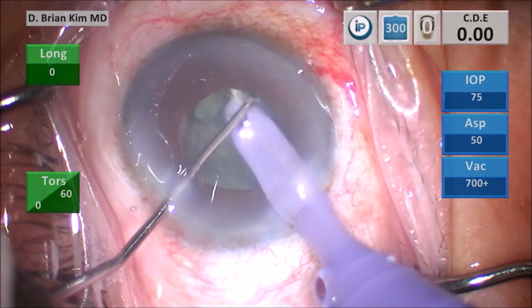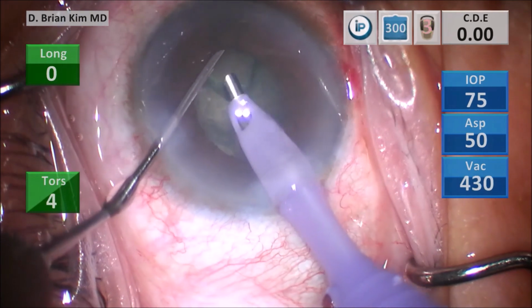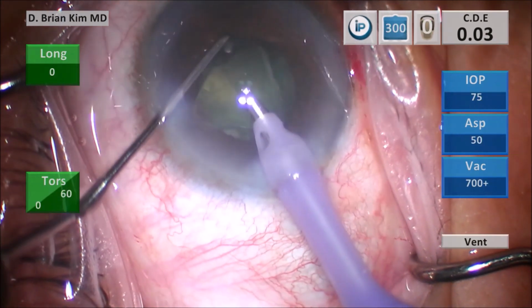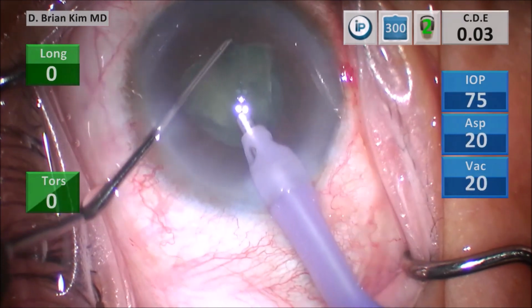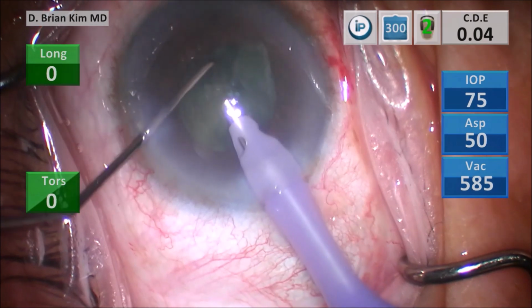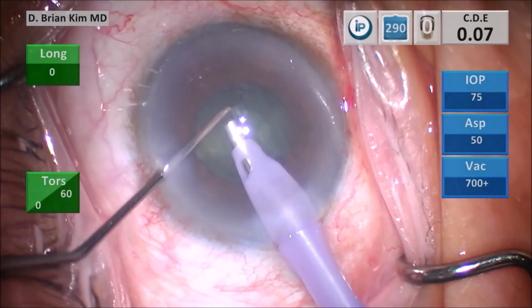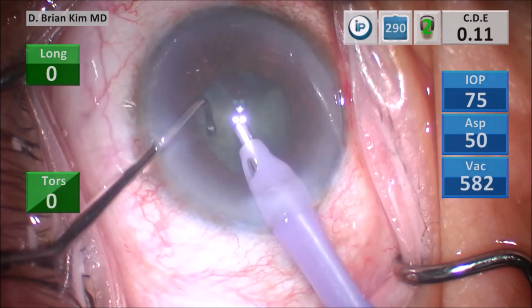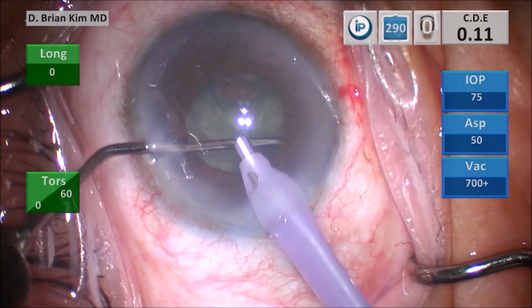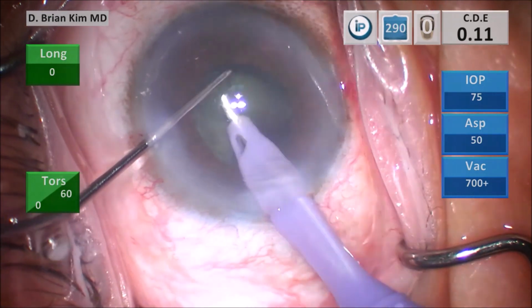I place the chopper out across the right heminucleus into the capsular fornix, pull the chopper centrally towards the phaco-tip, and then I crush and chop the right heminucleus. This is the cross-chop maneuver. I then begin successive mechanical fracturing forces, placing the chopper out to the equator, sandwiching the lens pieces between the chopper and the phaco-tip. Oftentimes, I'm placing the phaco-tip fairly deep into the capsular bag. I'm doing this without any phaco or vacuum in order to minimize any trauma or risk to the capsule.